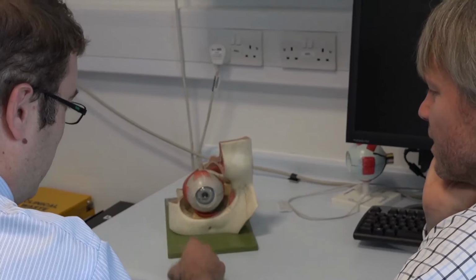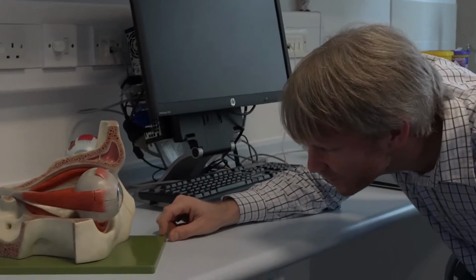So I have developed a computational model which calculates how light propagates in biological tissue, and then calculates how that light would be interpreted by an OCT system. And so we can simulate very realistically image formation in OCT.